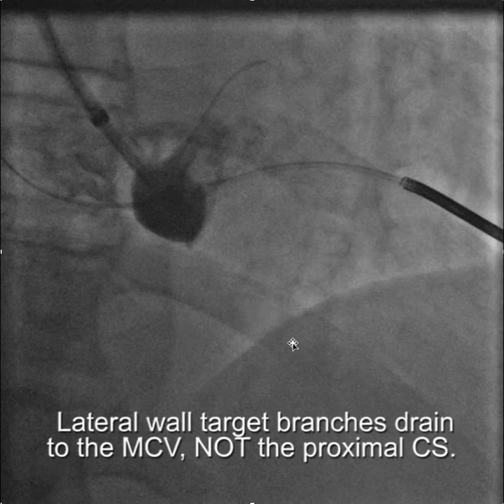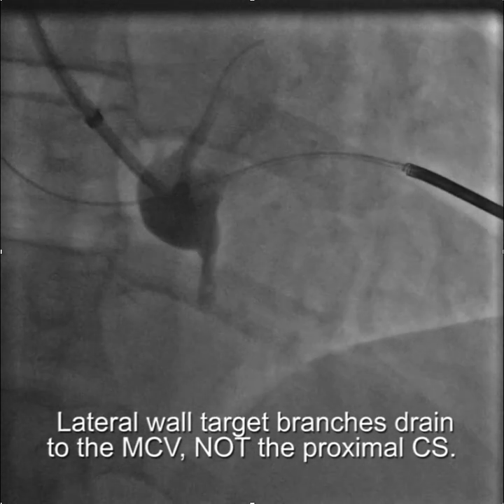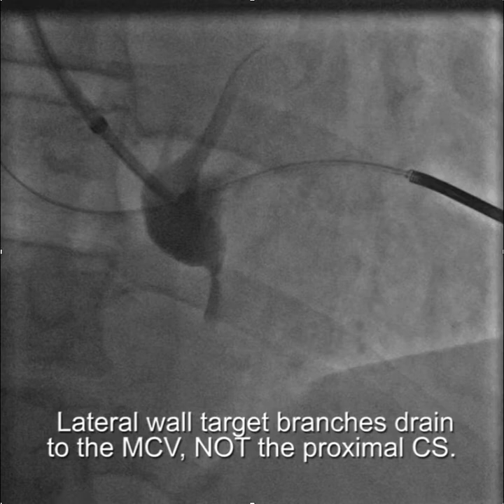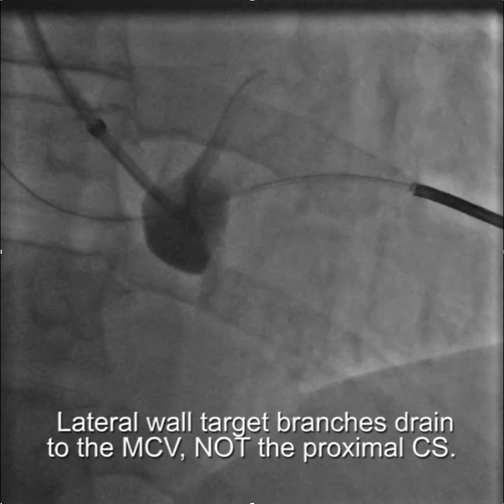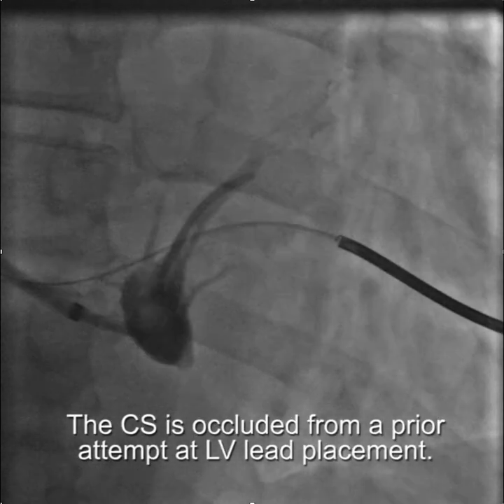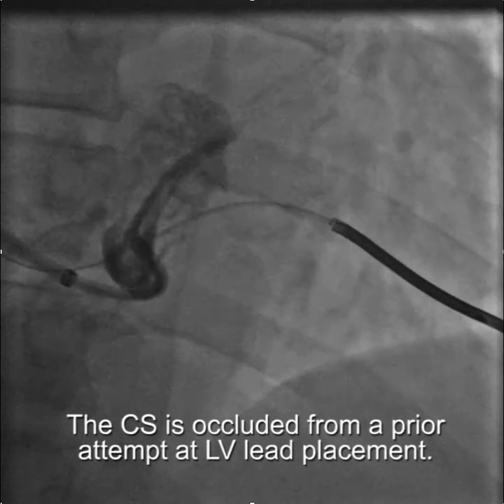So here we have a lateral situation where the lateral wall target branches drain to the middle cardiac vein and not the proximal CS as we would like them to. And you can see here that this is the middle cardiac vein here, and that the CS is occluded from a prior attempt at LV lead placement.